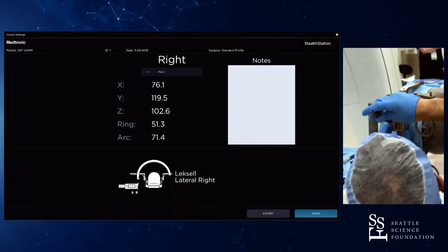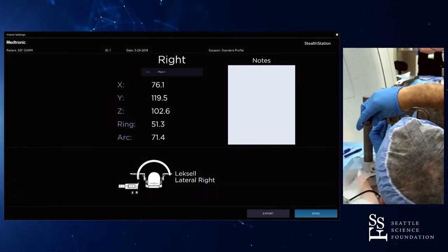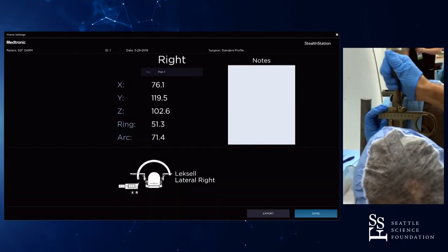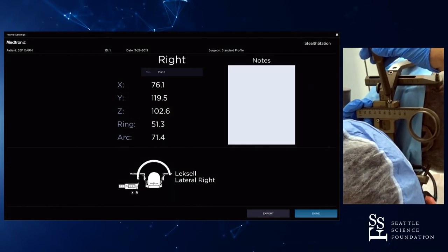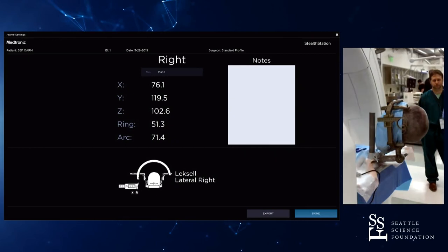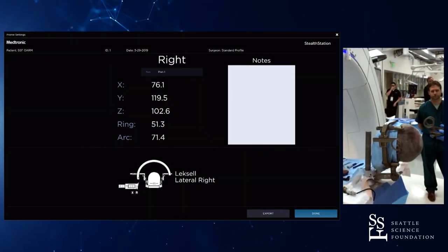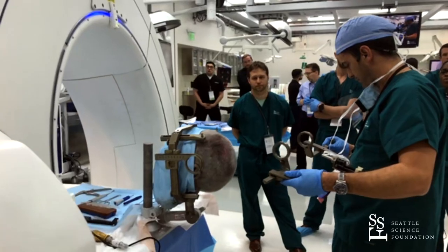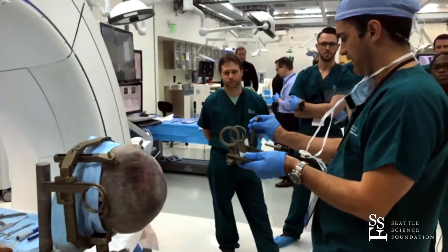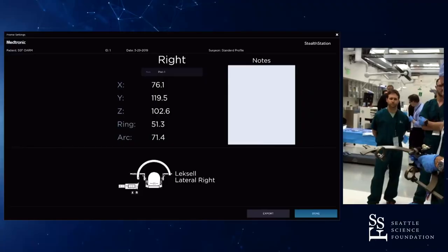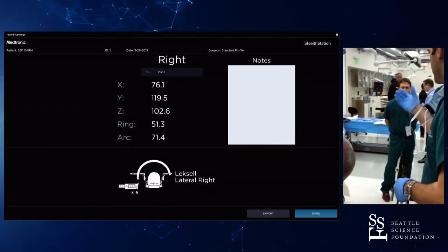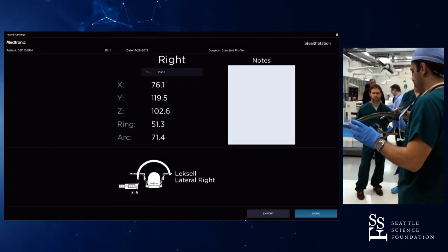Y is 119.5 and Z is 102.6. It's really important to check, double check, triple check where we are. The X is set on the arc, and our X is 76.1. I usually do this on a mayo stand so you have that elbow room to do it right. And our arc is 71.4. That's how we basically translate a plan done on the MRI to stereotactic coordinates with a stereotactic frame.